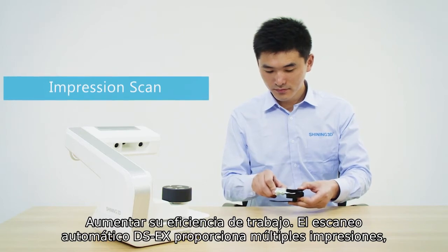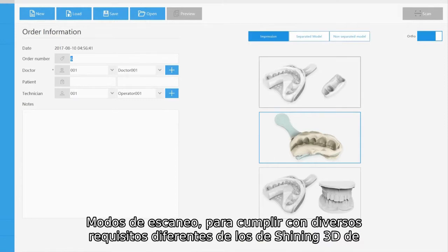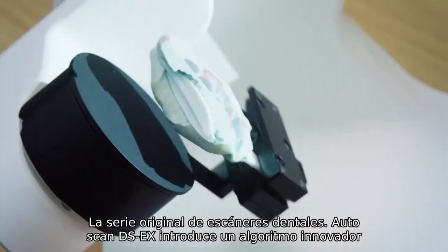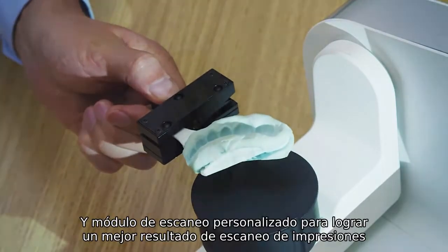Autoscan DS-EX provides multiple impression scan modes to meet your various requirements. Different from Shining 3D's original series of dental scanners, Autoscan DS-EX adopts an innovative algorithm and customized scan module to achieve better impression scan results.